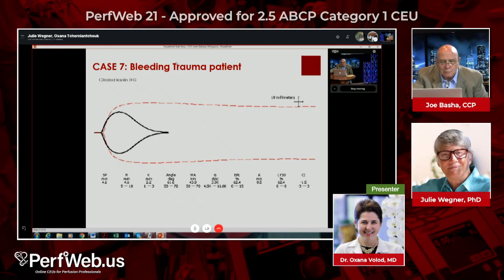So if it is not a trauma setting, in which setting would we see this particular patient? When a patient is on cardiopulmonary bypass, you would potentially be able to see this because of increased tPA. Also in the setting of liver disease, a liver transplant, when a new donor liver is implanted and there is a perfusion of the donor liver with the patient's blood. So that's the situation where you can see primary fibrinolysis and possibly consider, again, antifibrinolytic therapy instead.